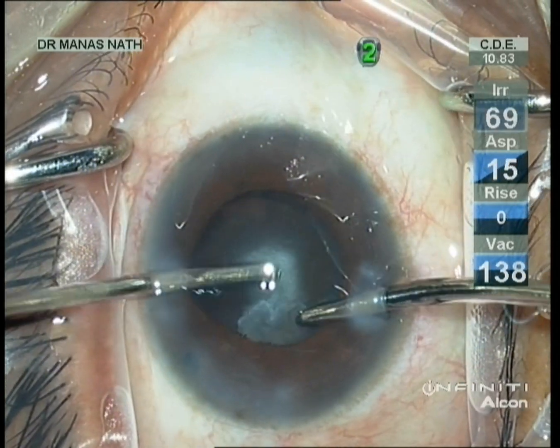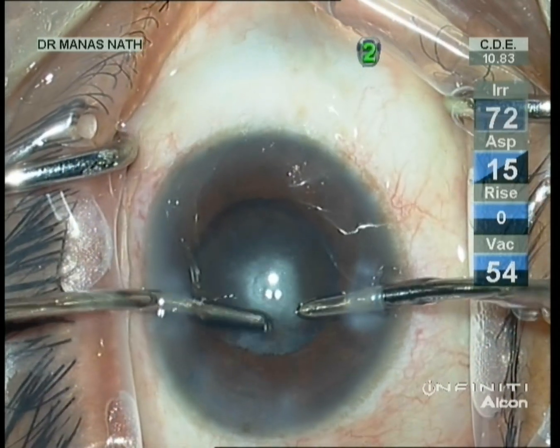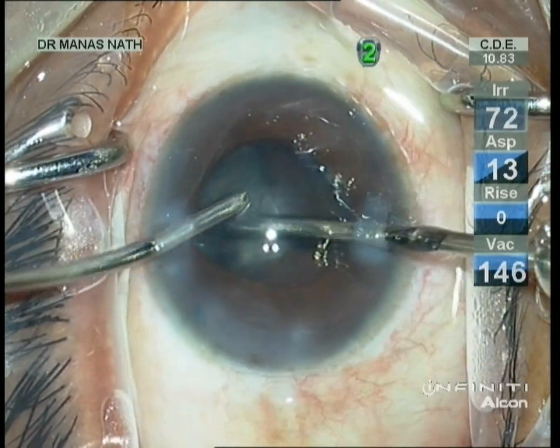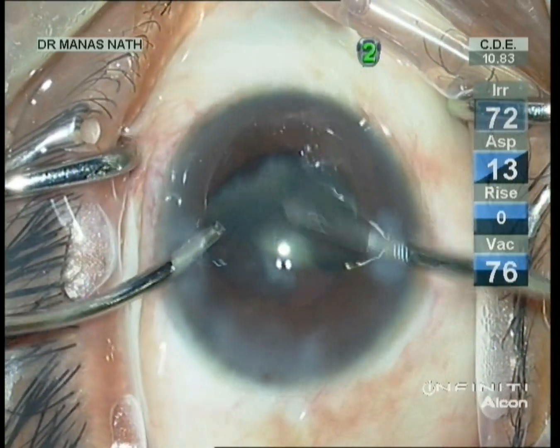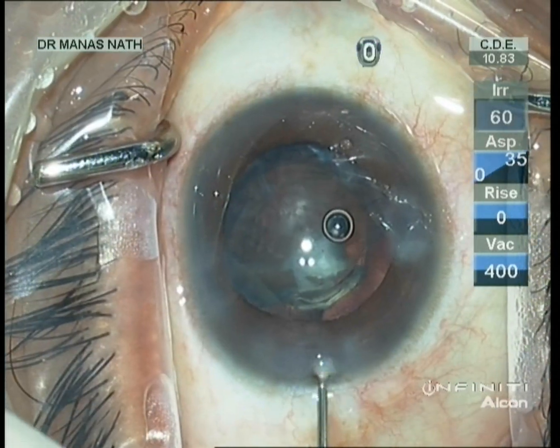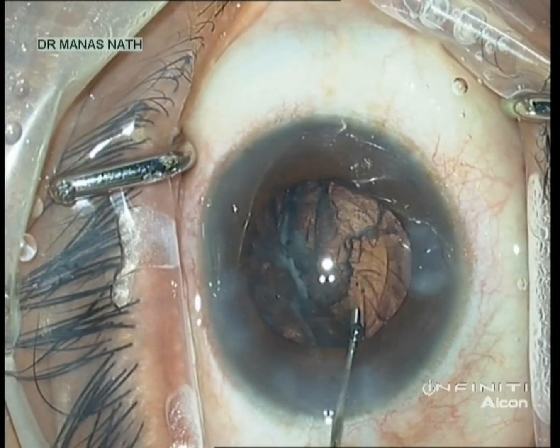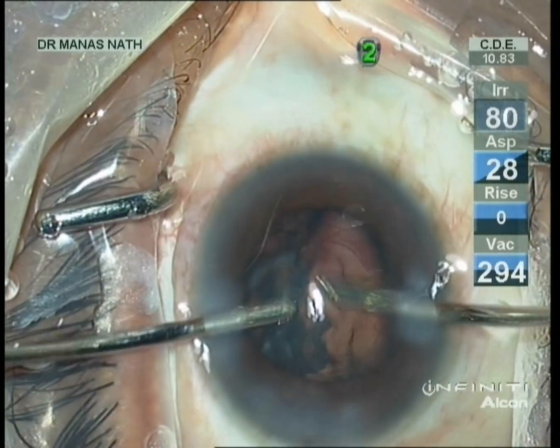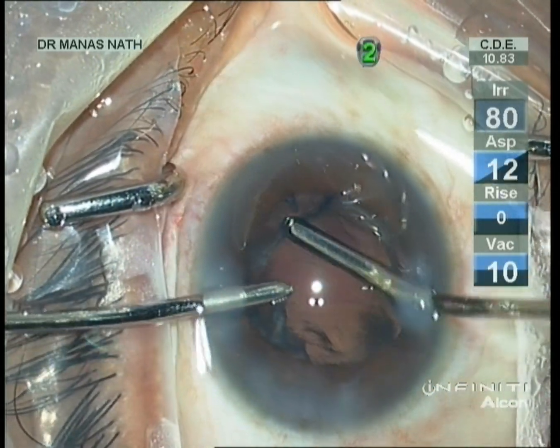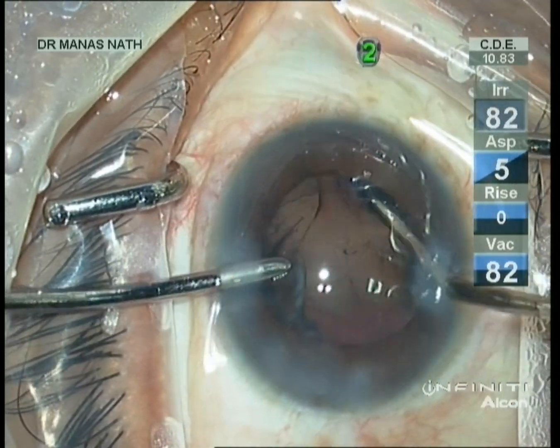You can see the dense posterior polar cataract. Now most of the epinucleus has been removed. The last sheet underneath — I am injecting viscoelastics so that it will push the posterior capsule a little bit behind. PC looks intact.